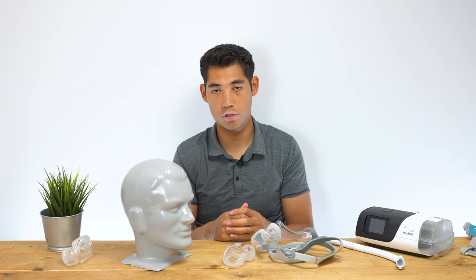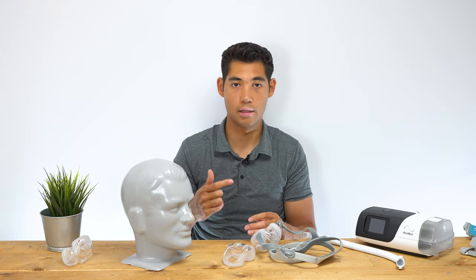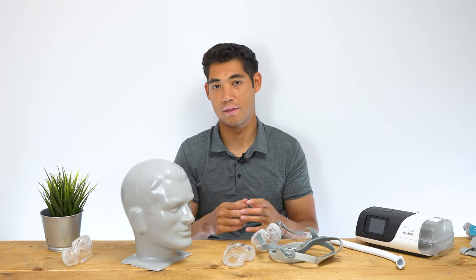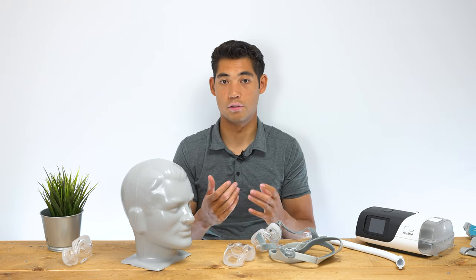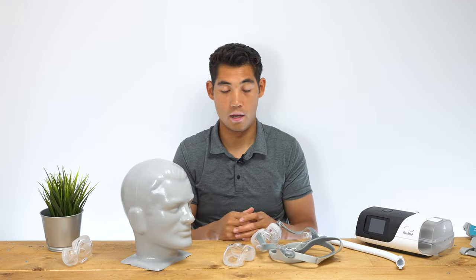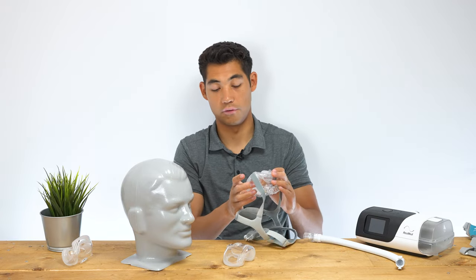Just piggybacking on that point — if you are a first-time CPAP user, you might want to start with something minimal like a DreamWear mask, which sits just under the nose, because you may find the adjustment to CPAP therapy a little easier. However, if you're known to breathe out of your mouth more often, then of course you have to go with a full face mask.